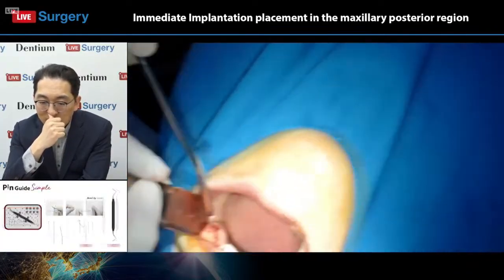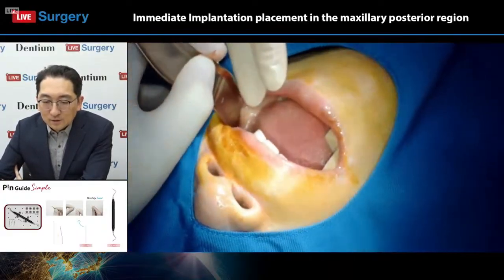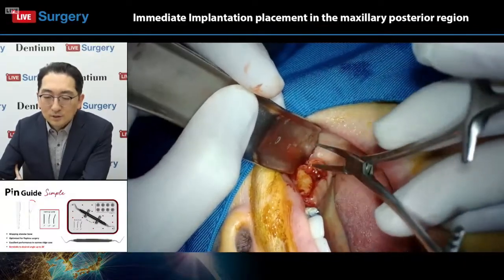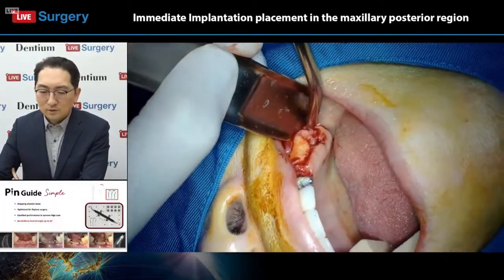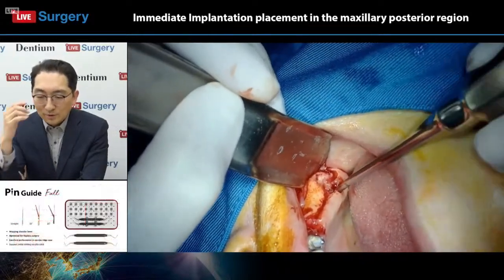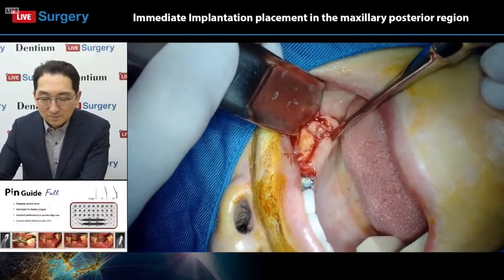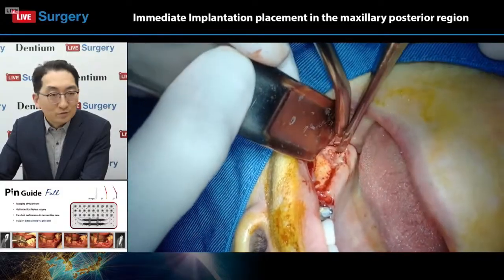Please understand that there is quite a bit of movement in the video as the camera is mounted on my head during filming. While fixing the camera externally eliminates moving, the posterior teeth are not captured well on camera. By mounting the camera on my forehead like this, as we are doing now, I can accurately capture exactly what I see. However, the video shakes when I move my head.